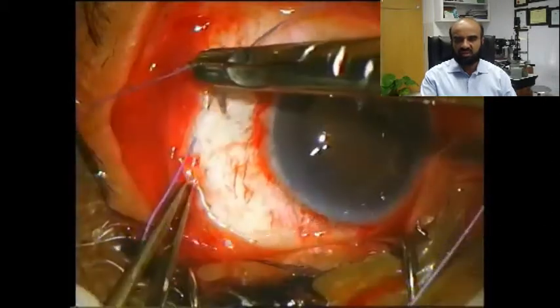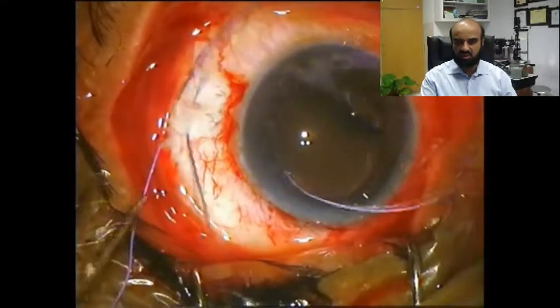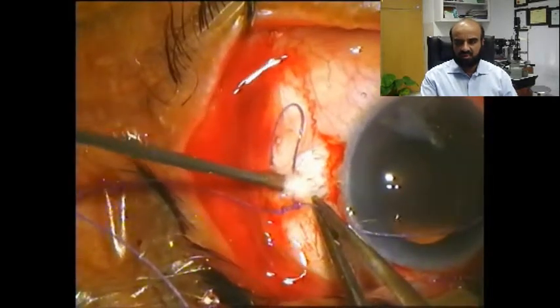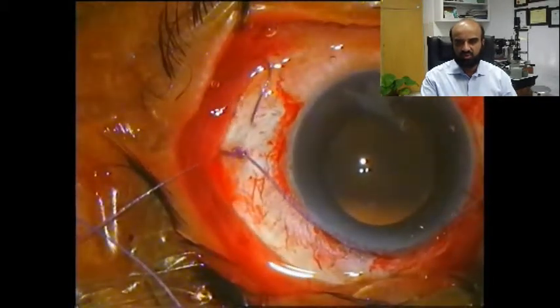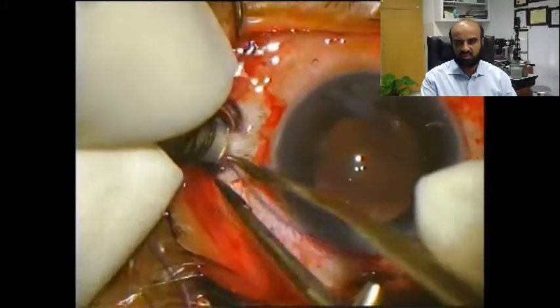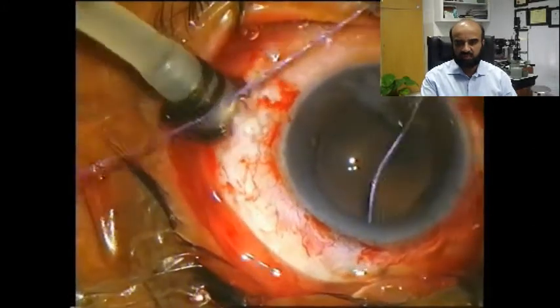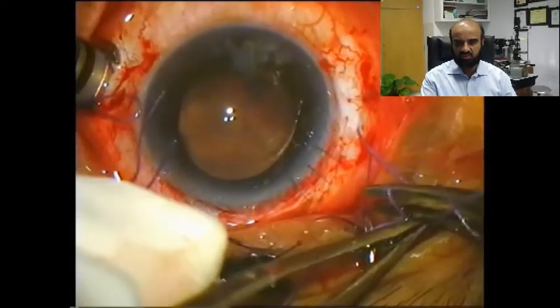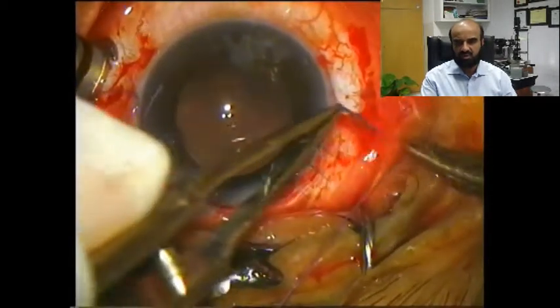First of all, we decided to strengthen the pre-placed IOL in the ciliary sulcus site. Then routine preparation of the three-port pars plana vitrectomy is underway. The irrigation cannula, as per routine, is placed first, irrigation was turned on and then turned off, and it is secured in place with the help of pre-placed stay sutures. Similar stay sutures are to be placed in the supratemporal and supranasal quadrants as well.